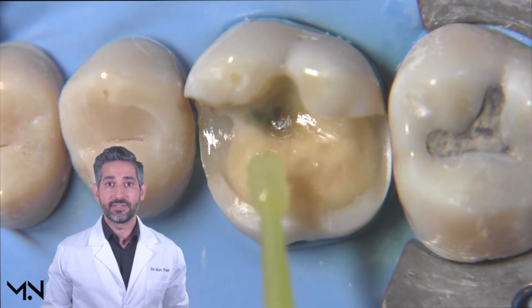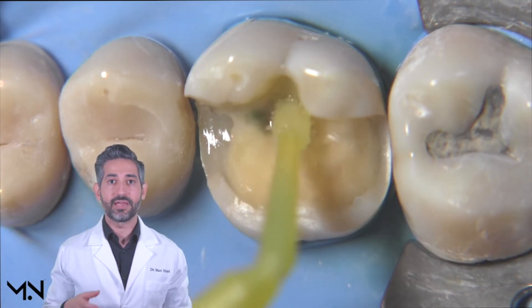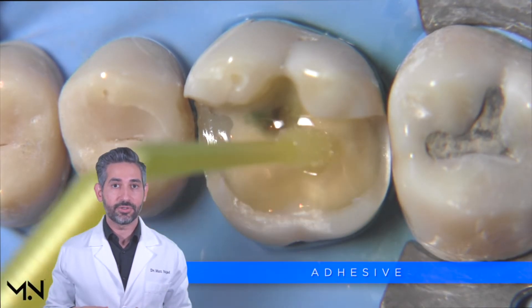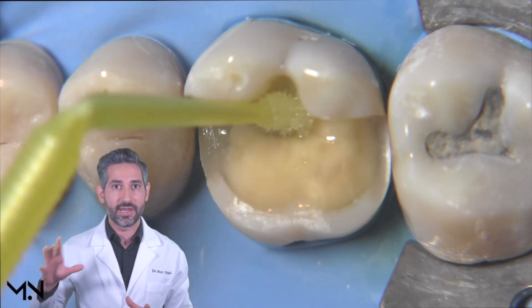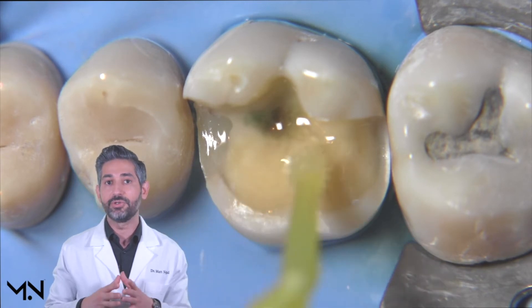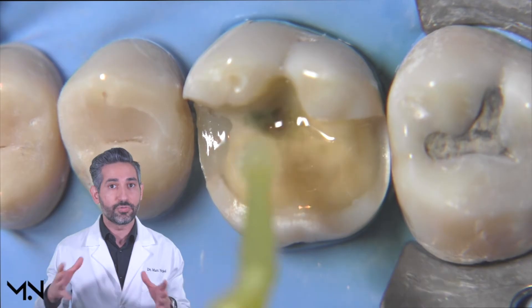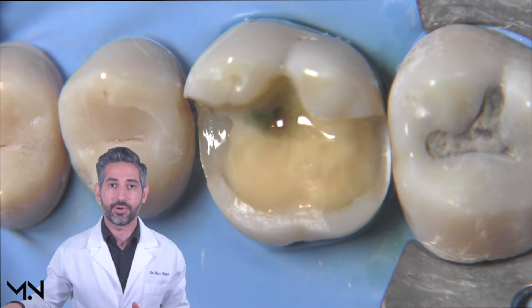Now that you've primed the dentin, you've begun forming the hybrid layer. In the next step, the goal is to apply the adhesive again to just the dentin surface. During immediate dentin sealing, you're focusing on the dentin, not the enamel, but in order to make sure you don't miss any dentin surface you do need to extend slightly past the DEJ. If you extend too far past and get on your enamel margins, you can always clean those up before you take your final impression.